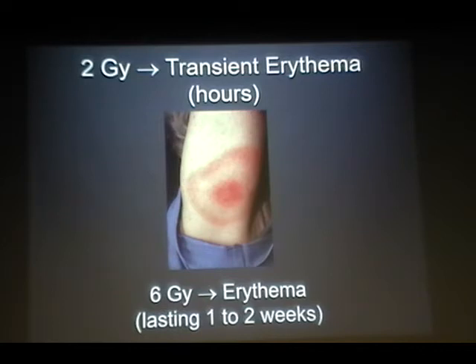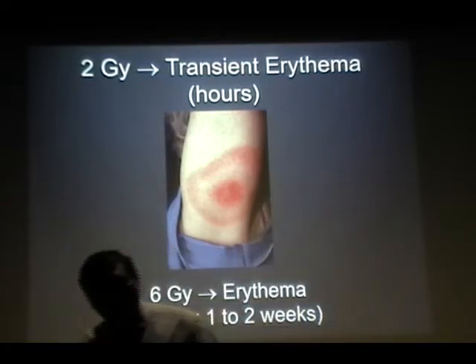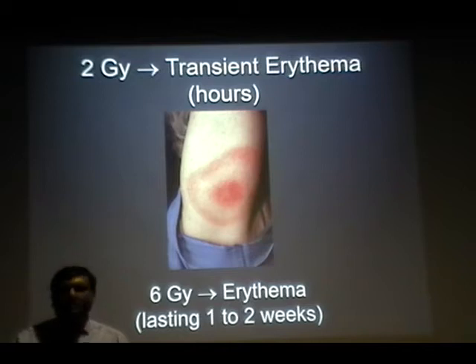Okay, if you have doubt, please get the patient out and check with some other protocols that are in place. Say for instance, in our dental radiology, you could take a film, put a key, and expose it to see whether the radiation is coming or not. That's the easiest, not pressing the button 100 times.